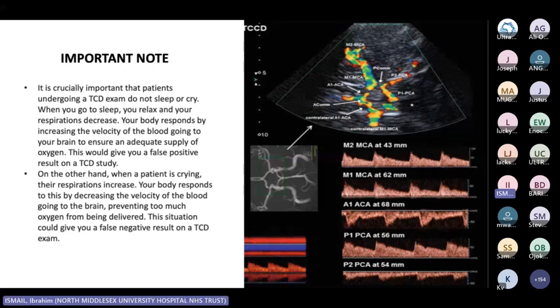But when they go into a tantrum and cry and cause a lot of distress, the results will become skewed, and it won't provide any diagnostic value to continue with that scan. In the same respect, if you're scanning a patient and they go to sleep, that can cause a false result. You always have to make sure that they're attentive and awake throughout the whole scan.